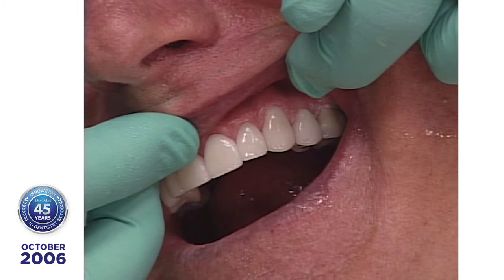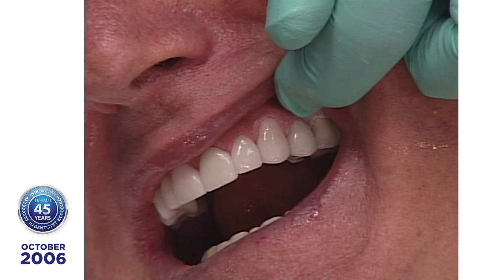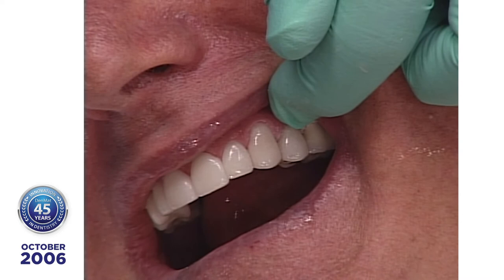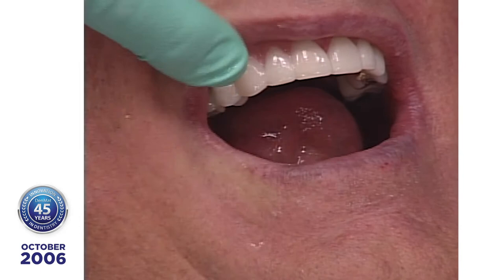Now think about what I haven't done. I haven't opened the embrasures yet. So when you do a try-in with a patient and you've got resin in there and those embrasures aren't open and you get started looking for what's, quote, not right, then that's what you're focused on. See, this is what you'd get on a try-in, something like that. And so I spend my time on the finishing and not so much on the try-in.